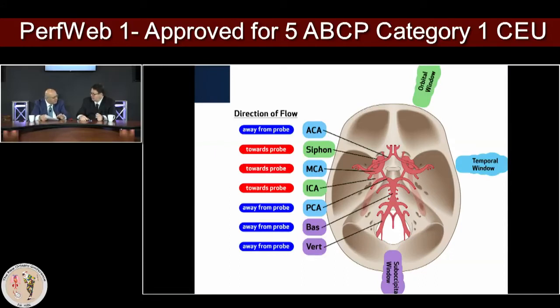Now, that's for his vascular surgery and carotids. For the heart, at Houston Methodist you are using TCD on all of your open heart surgeries as well. Just yesterday we had a type A, and it was affecting the brachiocephalic flow, so there was a stunning difference again between right and left.